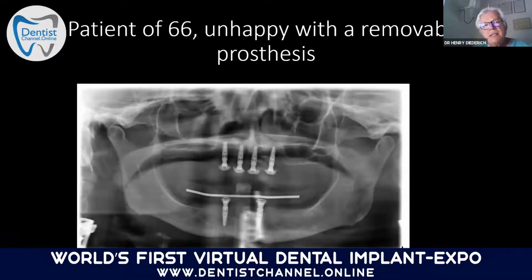Here, this lady also, she was very unhappy. You see, 66 years young or old, and she was very unhappy because the doctor told her, you will get a fixed prosthesis. Yes, but for the doctor, it was fixed on 4 implants, and for the lady, at the end of the day, it was a removable prosthesis. So the patient was very unhappy. And you see, the problem is, the colleague could just work on the anterior part because there was bone, and as he was not trained in sinus lift or bone grafting, he did nothing else. But the patient was very unhappy, and she wanted fixed teeth.